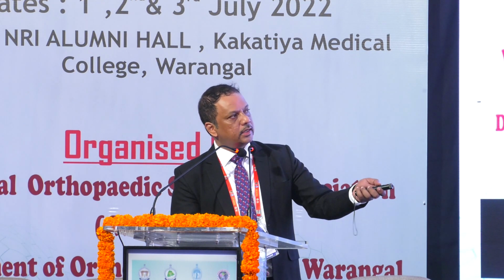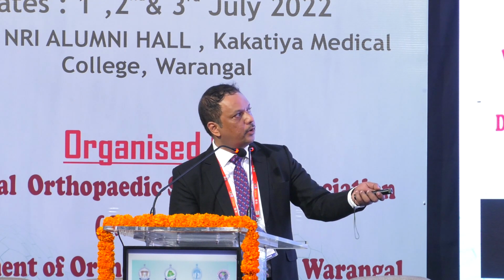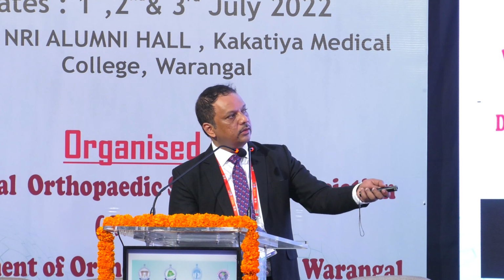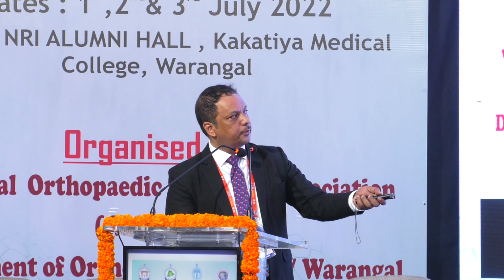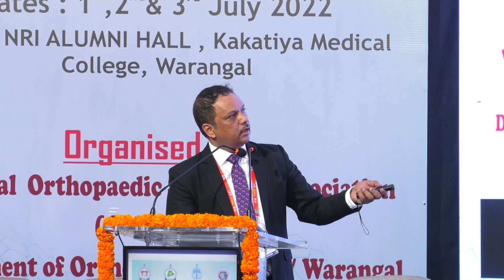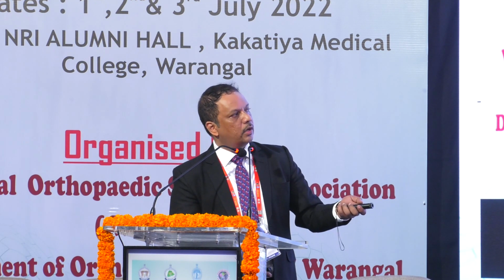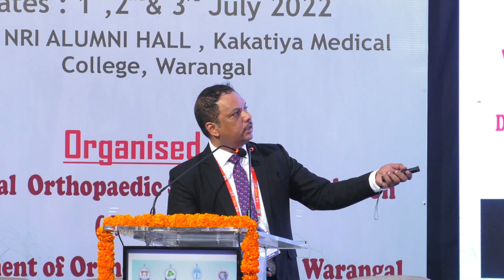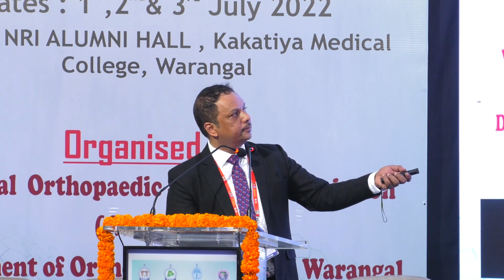The lunate fossa itself, you need to go directly there at this point, engage the fragment, push that fragment up, elevate the fragment here. You use your levers to elevate the entire depressed articular surface. Use a raft like this at this point, okay? And then you can use any of these techniques, cross K-wire there. With the plate, you can keep the wires if you want, but if you feel the plate is holding on nicely, you can take off the wires later. Okay? So that additional screw is also very useful a lot of times.